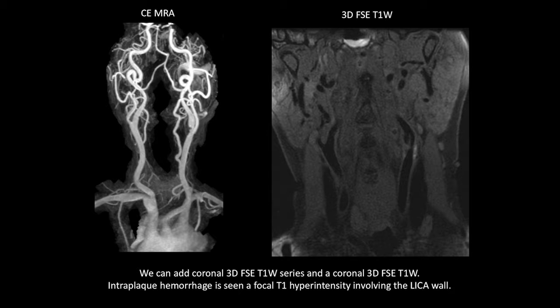So again, that same 3D fast spin echo sequence that I use post, well, let's just run it pre. And again, we get this excellent blood suppression. We can see the intraplaque hemorrhage. We also do an MP RAGE sequence. Again, you can just pull out your standard 3D FSPGR sequence, one that allows some sort of fat suppression, and then an inversion pulse to null out the T1 of flowing blood, and you can see the intraplaque hemorrhage. And so again, it's readily available.